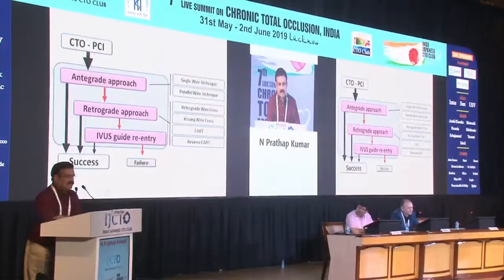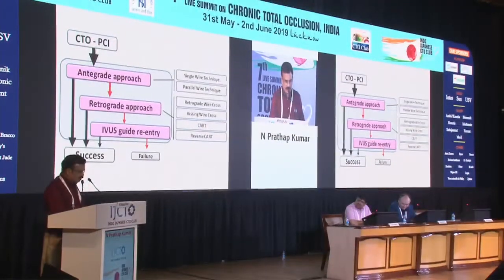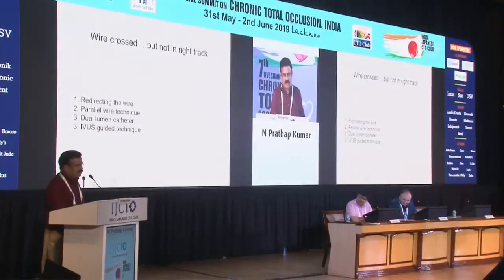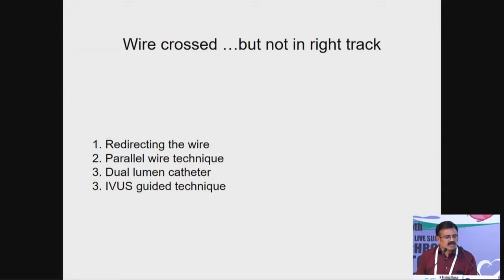In CTO PCI, you have a single wire technique or a parallel wire technique, in antegrade approach and retrograde. I'm not going into the details, I'm just going to the parallel wire technique. When a wire crosses, but not in the right track, you have only 4 techniques to come out of that. You can redirect the wire, you can have a parallel wire technique, you can have a dual lumen catheter, or you can have an IVUS guided technique.